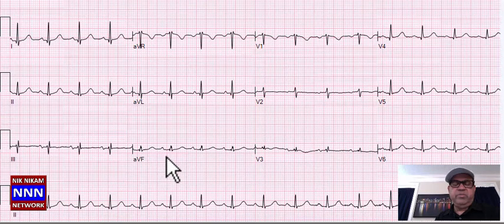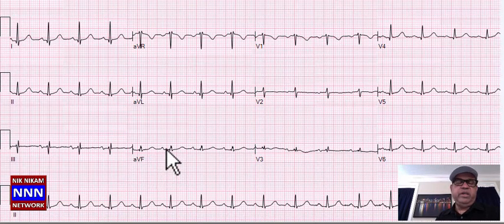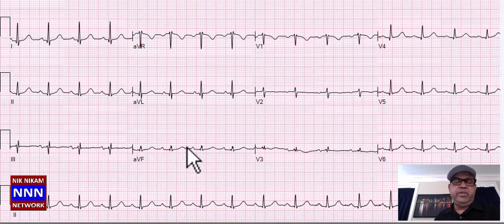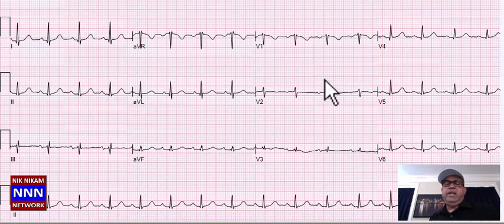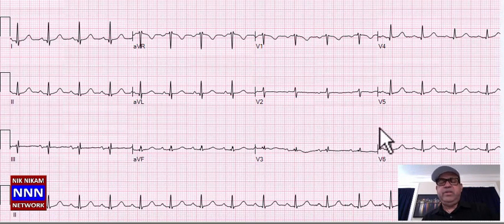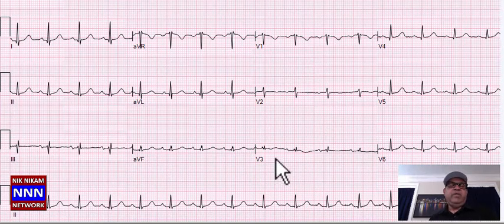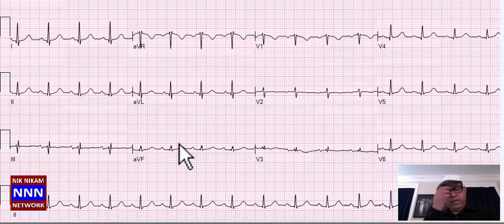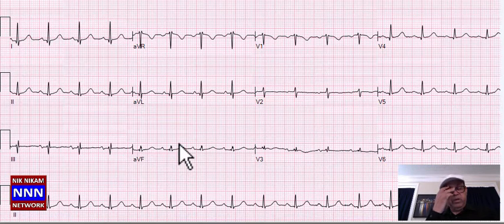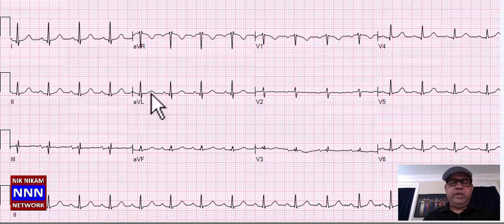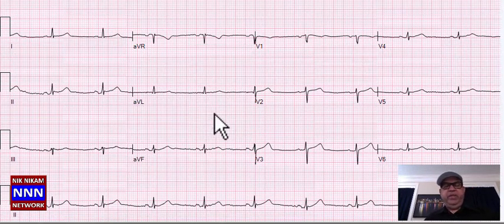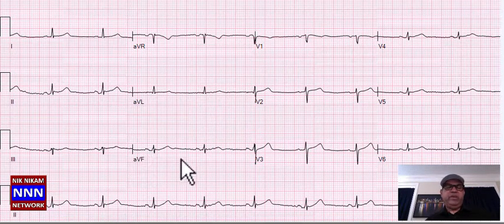Sinus rhythm — inferior leads show loss of R-waves in the inferior leads, which needs to be looked into. Anteriorly some non-specific T-wave changes, nothing spectacular. I would get another EKG to make sure the right side of the heart and inferior wall are okay, so that no significant pathology exists.